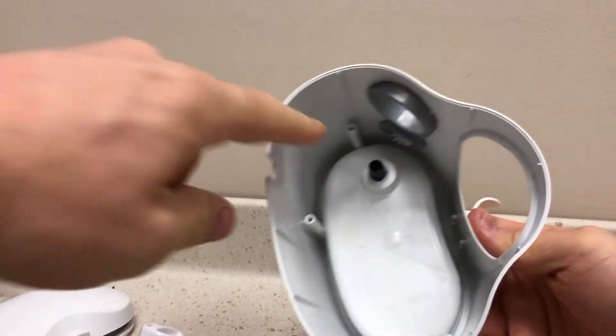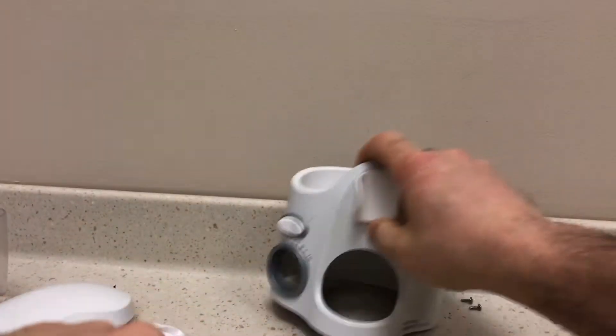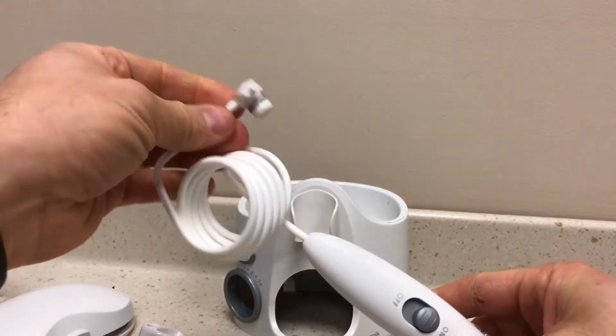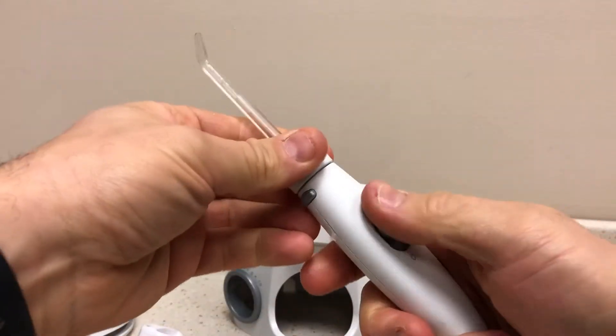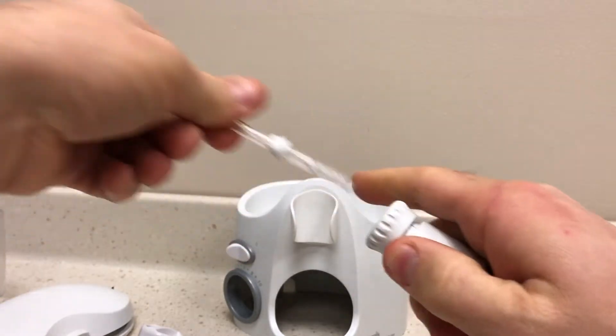Water from the reservoir enters here, enters into the unit, and then gets ejected out through here and out the end. This part is basically just a pause — a stop — it doesn't do anything. Then you press this and the tips come out.